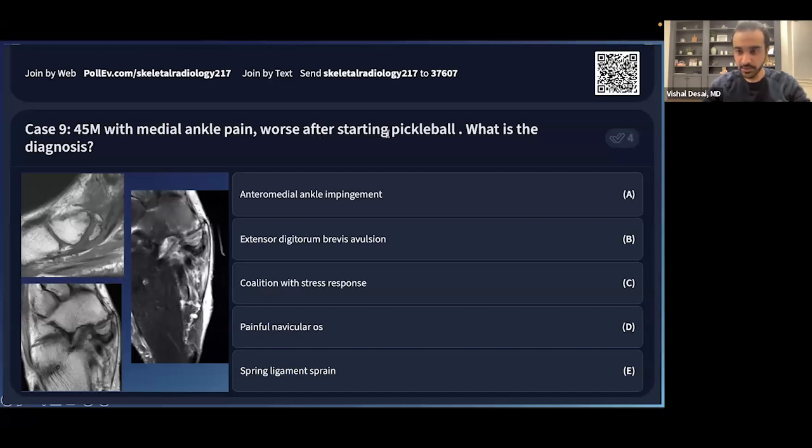Okay, got a couple answers coming in, another 10 seconds. So I purposely picked a somewhat atypical case. Let's see how we do with it.